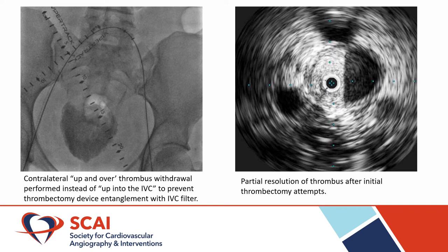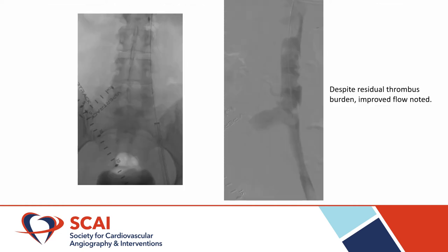As the patient had an IVC filter, we did not advance the ClotTriever device up into the inferior vena cava for the risk of getting entangled with the filter. Instead, we used the up-and-over technique, as shown here, to perform contralateral and ipsilateral thrombus withdrawal. The intravascular ultrasound image on the right shows the partial resolution of thrombus within the left external iliac vein.